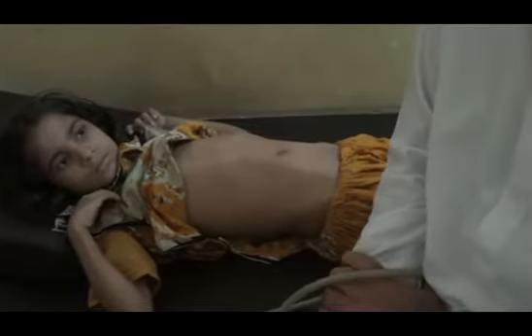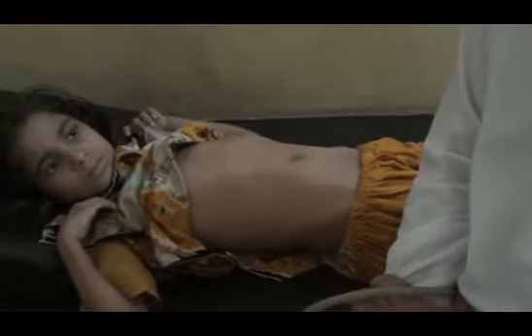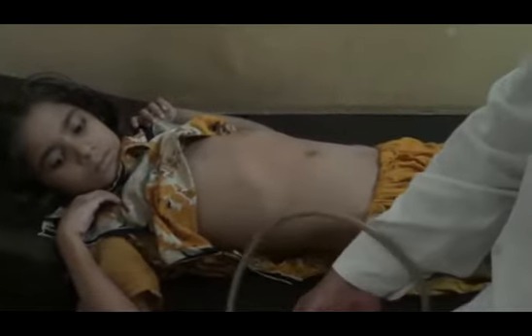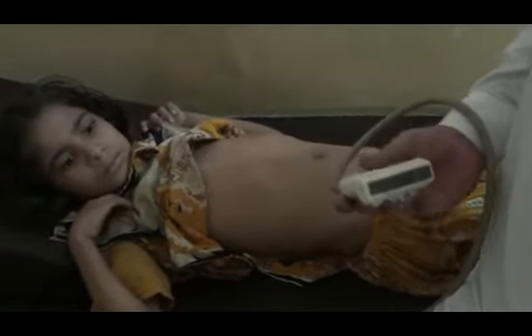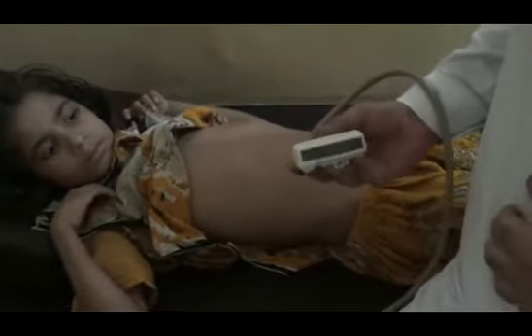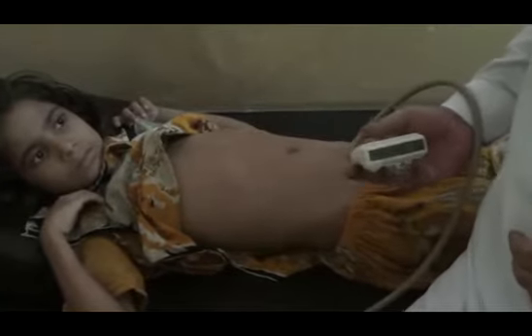I have a 10 years old girl who has been referred with the complaint of PUO for the last 3 months, and has been taking medicines for the last 3 months. This is the first ultrasound that she has been referred for, to rule out any pathology if we can by ultrasound. And no clinical or laboratory investigative procedures have been provided.